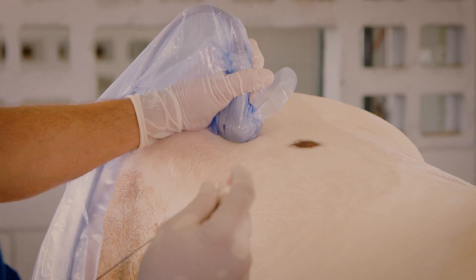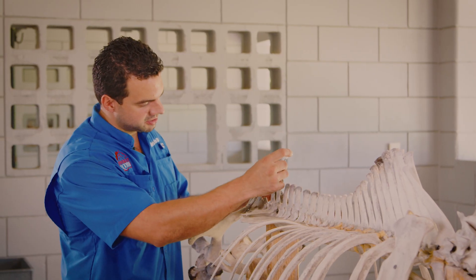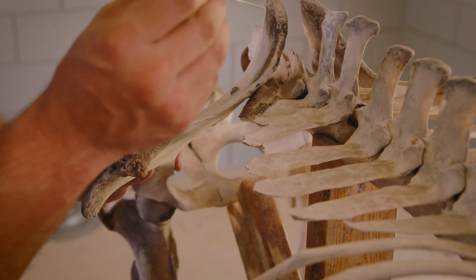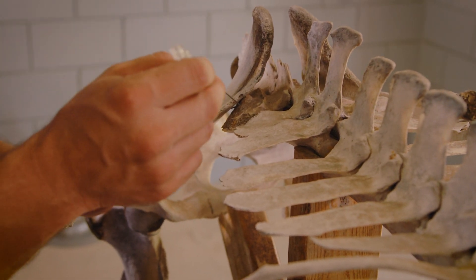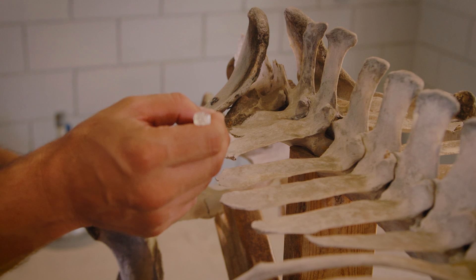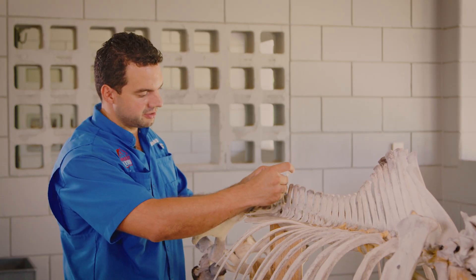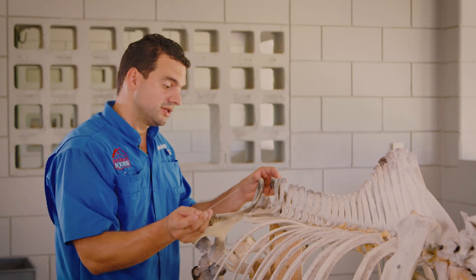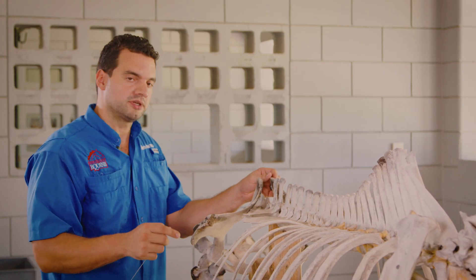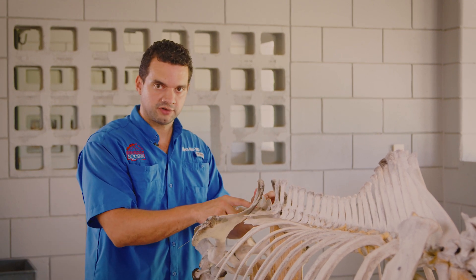We find out with the ultrasound where the entrance to the joint is. This is the pelvis, this is the sacrum — the junction between the pelvis and the sacrum is called the sacroiliac joint, and we put the needle right here in the sacroiliac joint. It's very important that we treat two parts: the cranial part and the caudal part of the sacroiliac joint.